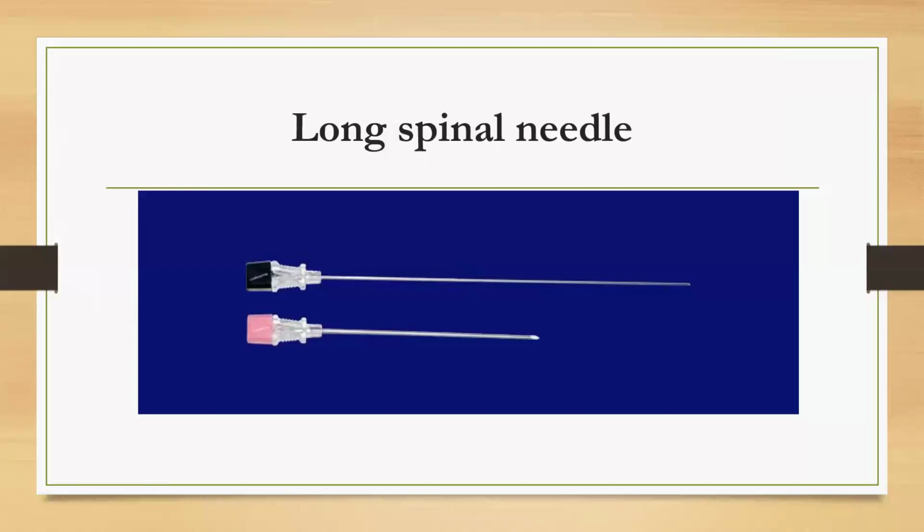120 mm, sorry, there are 120 mm and 150 mm, both commonly used. Correct. Fantastic. So 12 centimeter and 15 centimeter, that is 120 millimeter or 150 millimeter, both are used. What are the various indications of the long spinal needle?